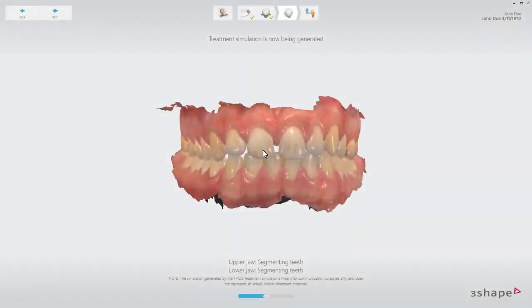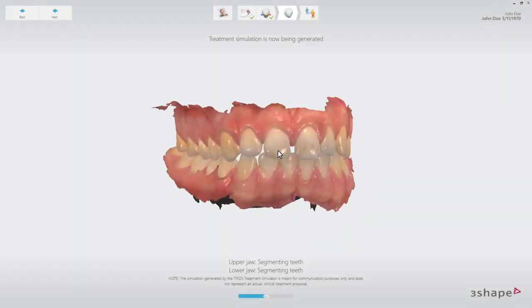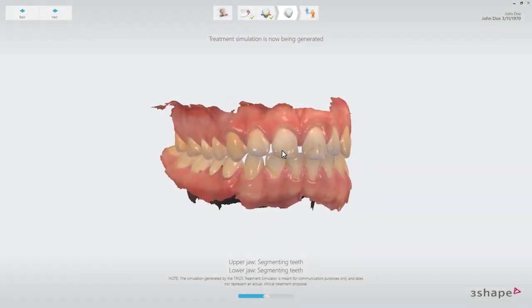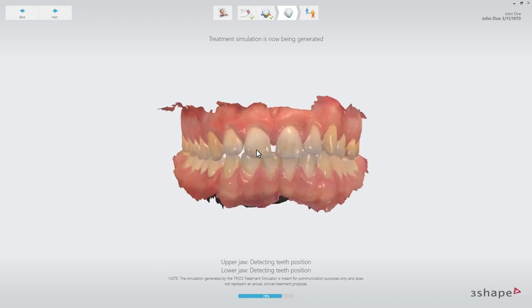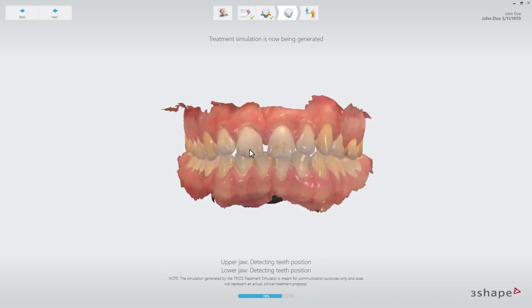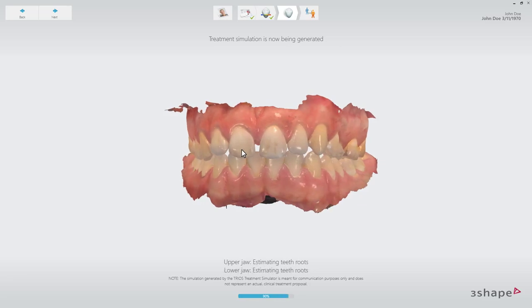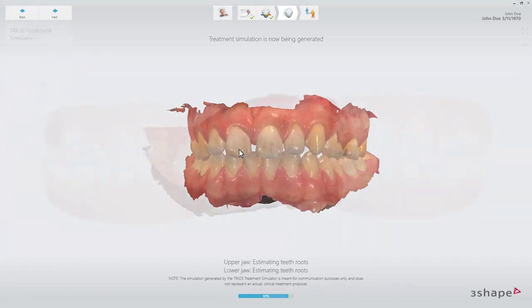While the Treatment Simulator is loading, it is possible to interact with the scan so that you can engage the patient in conversation — for example, about treatment options while waiting for the simulation to be generated.